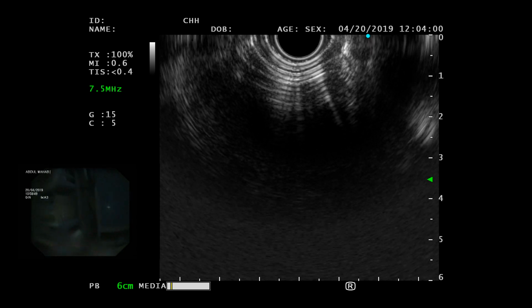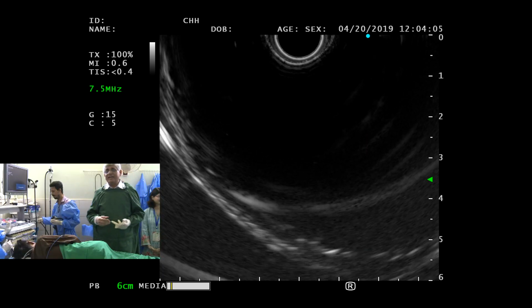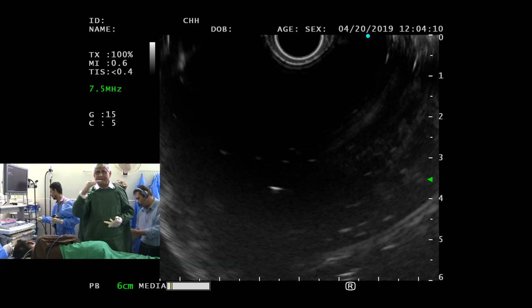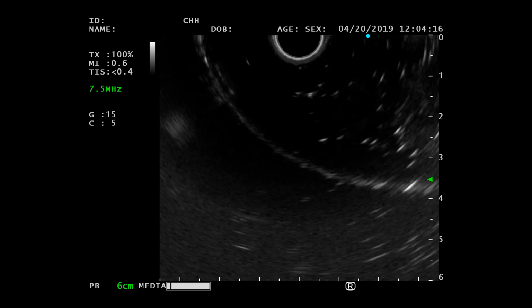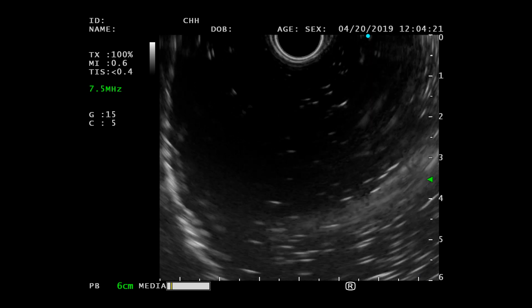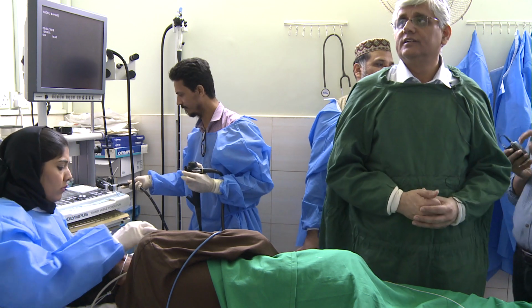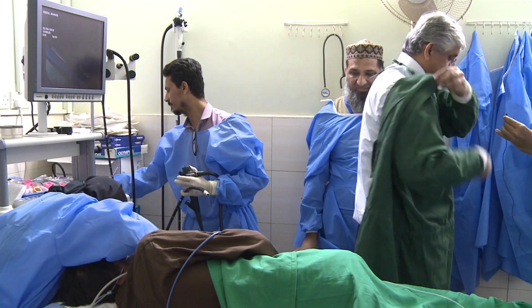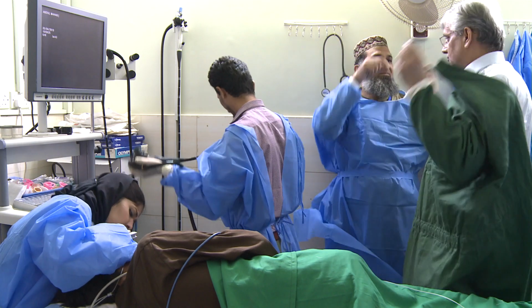साथ जी, खालिद दादा तो कहते सिर्फ 3 पासेस करने, तो आपने 10 पासेस किए. सर, मैंने इसलिए किए कि मुझे उसकी जो हॉरिजॉन्टल और लेंथवाइज नीडल उस तरह मिल नहीं रही थी. Now, I think that is reasonable. एक तो ये चीज़ है कि इसकी lymph node की length बहुत कम थी. So in the vertical length in this case, you won't get that much tissue. So in this case, it's very reasonable to go 5, 6, 7 times because the length of penetration in the lymph node there is really small. What did you do then?